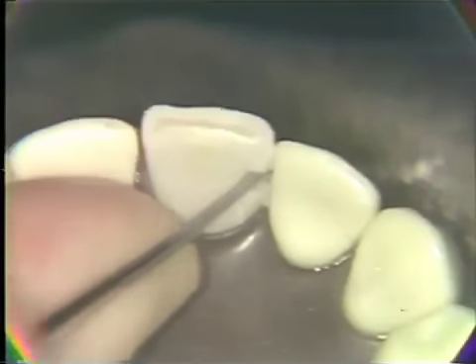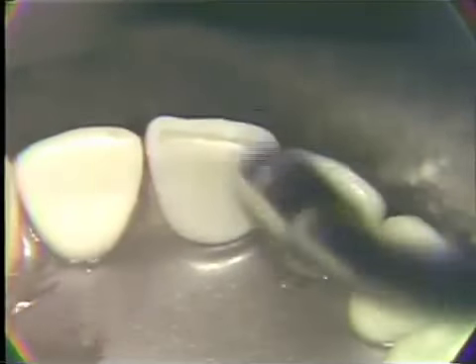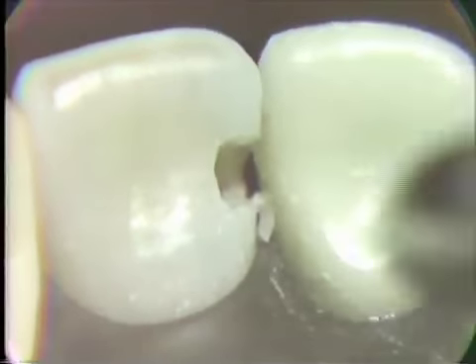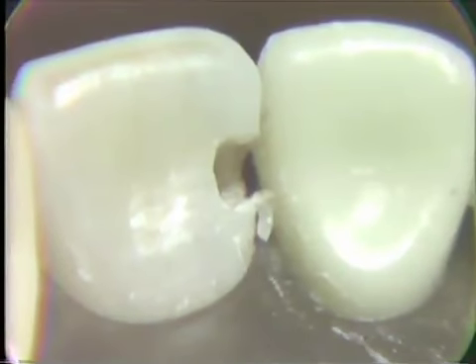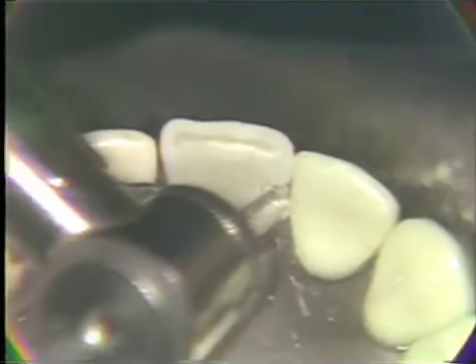The labial wall is to really be a long curvature, fairly open preparation. Again, I see that we're going to need to come back to the rotary instrument and extend that incisal wall a bit more in the incisal area.